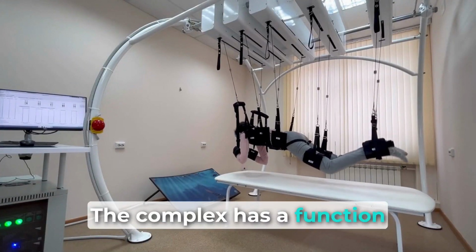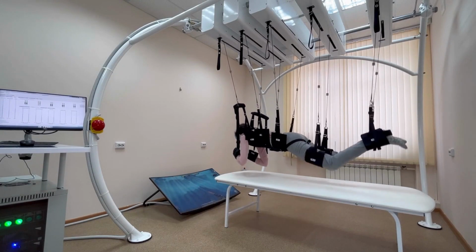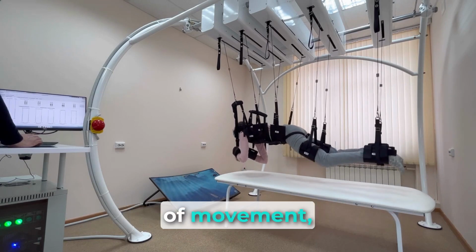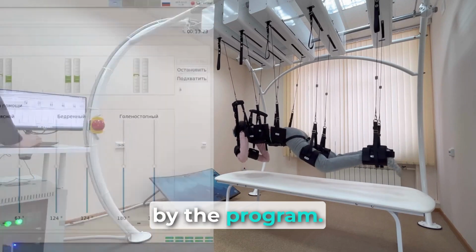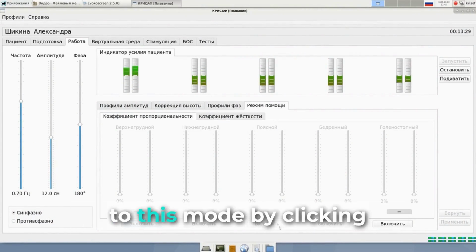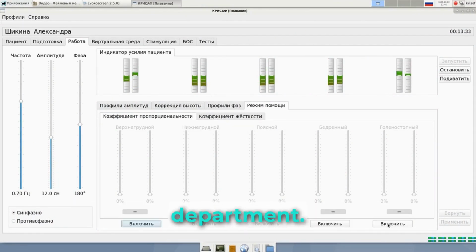The complex has a function called assistance mode, or assistive mode. It is a mode in which we create the opportunity for the patient to participate in the construction of movement and change the amplitude of movement. The frequency is set by the program. On the Help Mode tab, the operator can switch each group of actuators to this mode by clicking the Enable button under the selected department.